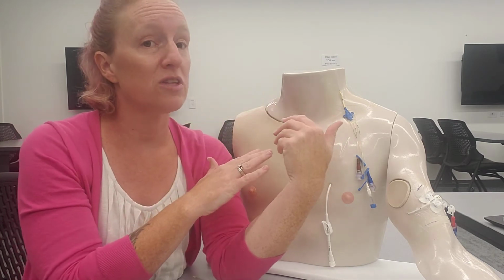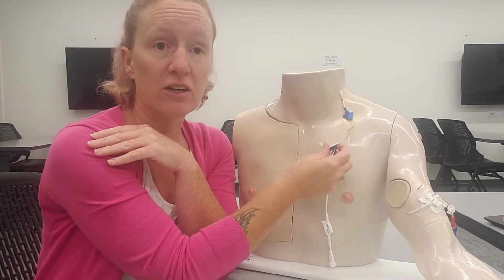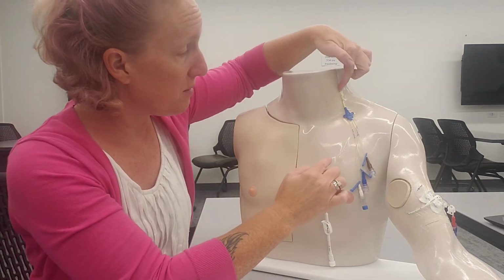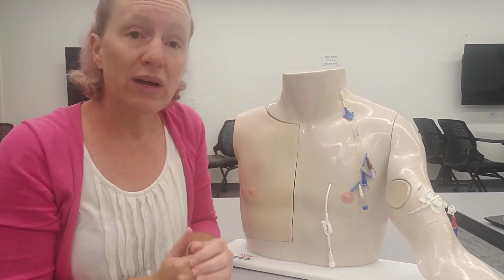We move into central lines. They're going to usually be in for a little bit longer. However, if we get somebody who has a central line like this, which is an IJ, an internal jugular, we're going to be really cautious with it, because that's a really short step from here to the superior vena cava, right? That's a real quick way that we're going to go, and so that increases our chance of infection, right? Short tubes, short time before infection sets in. Long tubes, longer time for that bacteria to climb up.